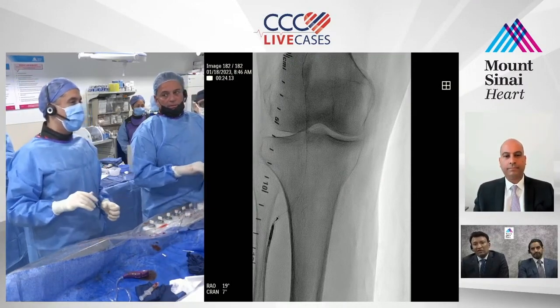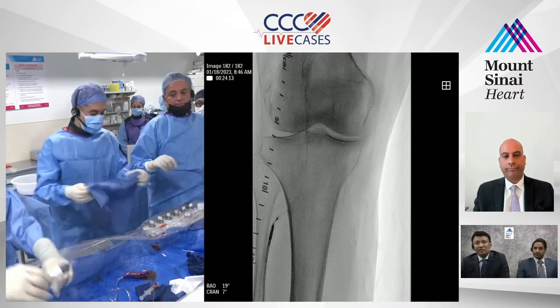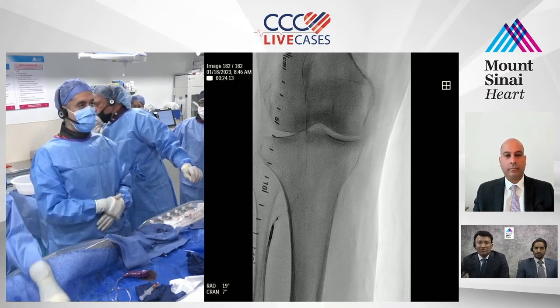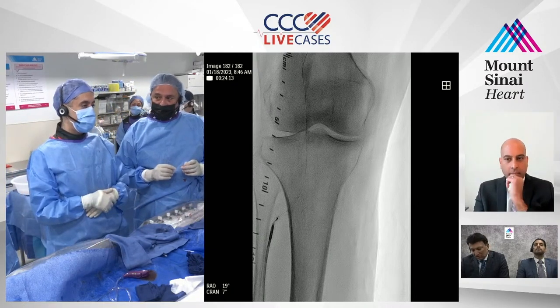The Outback is bulkier than it looks. Oh, no question. Especially the bends, when it goes through the bends, even aortic, even a bifurcation over, bends, it has difficulty. Correct. So there's no way it's going to make these bends. The only question is, we can't straighten out that bend by doing any sort of maneuver.